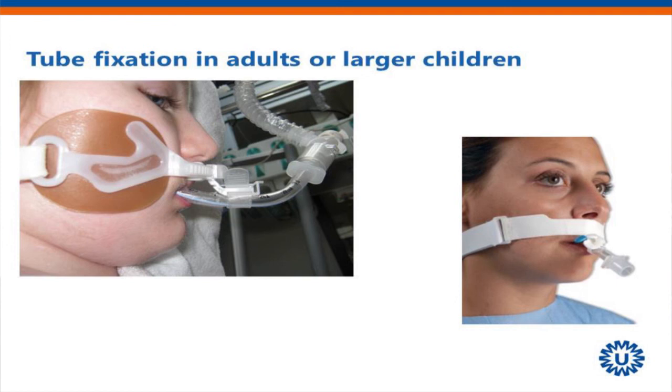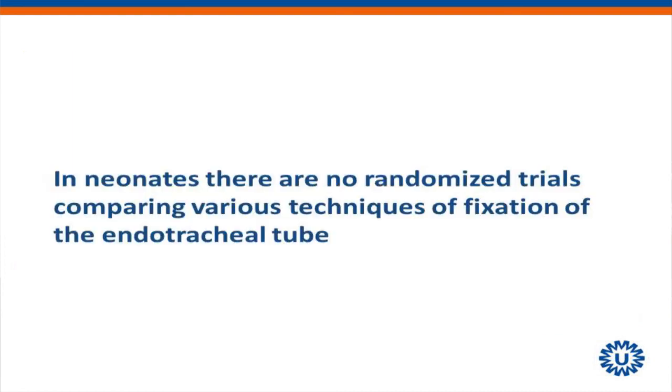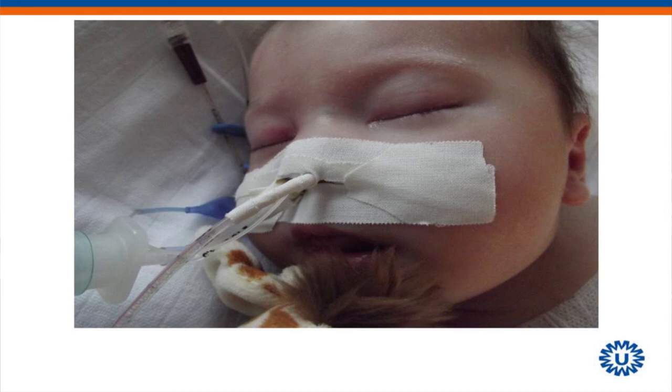So in adults and children, it's quite easy to fix your endotracheal tube. But in neonates, there are no trials comparing various techniques of fixation. This is the way we fix our endotracheal tubes. And I think this is the way most hospitals will do it, yeah, with a plaster.